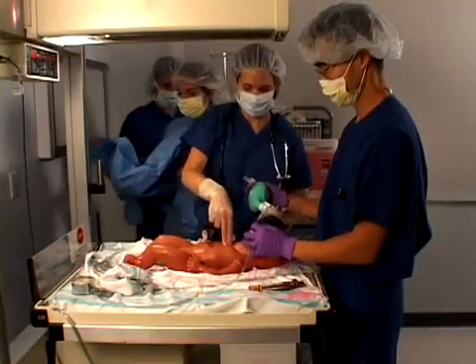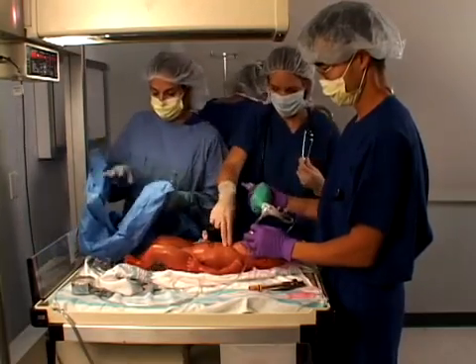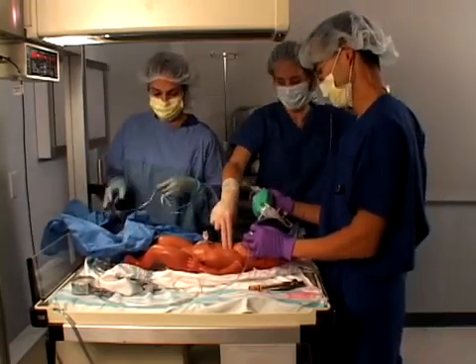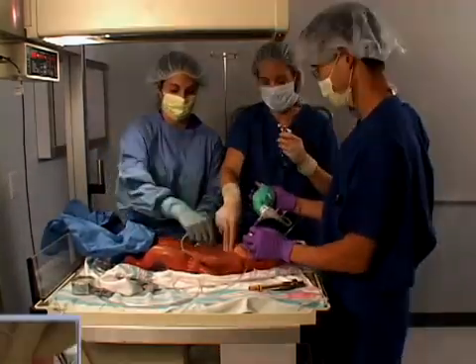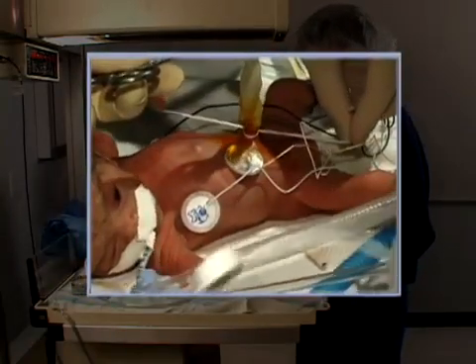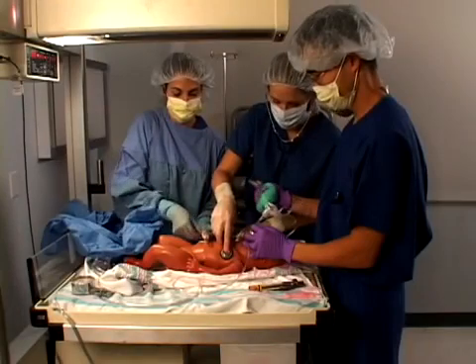Two different routes and 2 different doses present a risk for medication error. Be certain that syringes are labeled and medication administered correctly. To insert an umbilical venous catheter, first place an umbilical tape around the base of the cord.